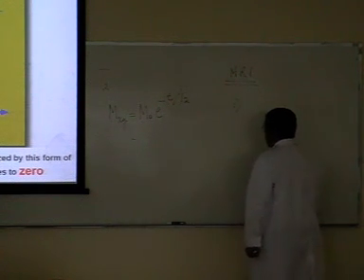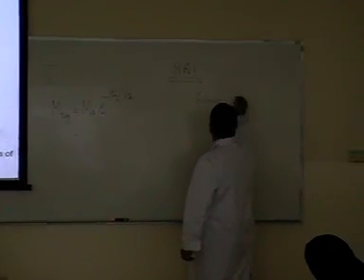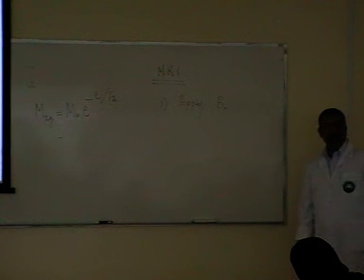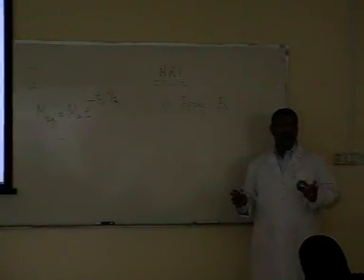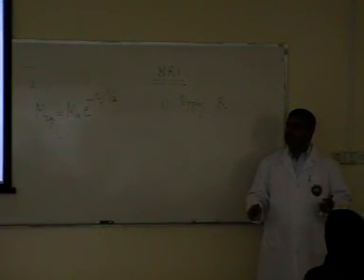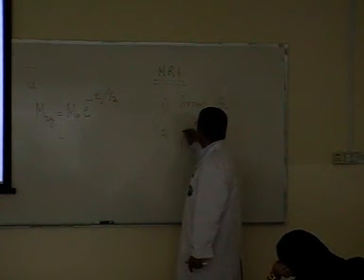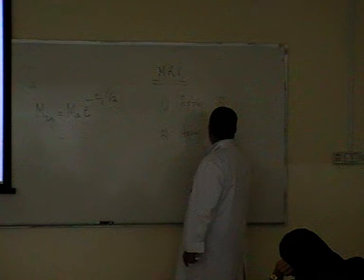So this is the MRI procedure. In the first part, we simply apply B0, and I'm going to come back to why I call it B0 in a few minutes. But the first thing is I apply B0, and then I know what's going to happen. I am going to get net magnetization. And then step number 2, I'm going to apply an RF signal.